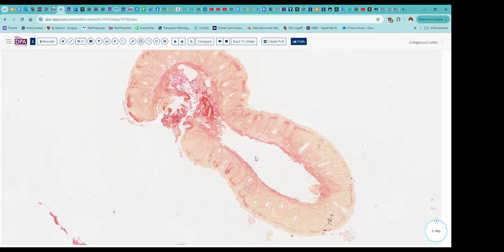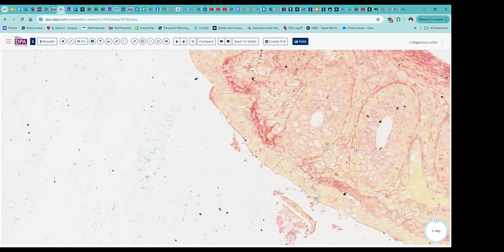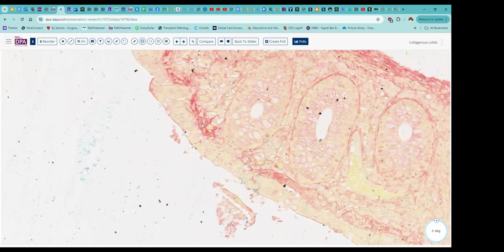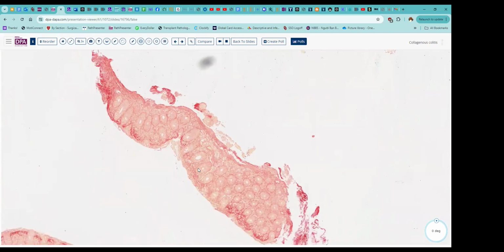In general, I don't make this diagnosis if I don't have another finding as well, which is some evidence of surface epithelial damage. Now, you can't appreciate that here because we're just highlighting the basal lamina thickening, but you'd like to see something like we had in the prior slide with either erosion of the surface or active intraepithelial inflammation, distortion of the surface epithelial appearance.